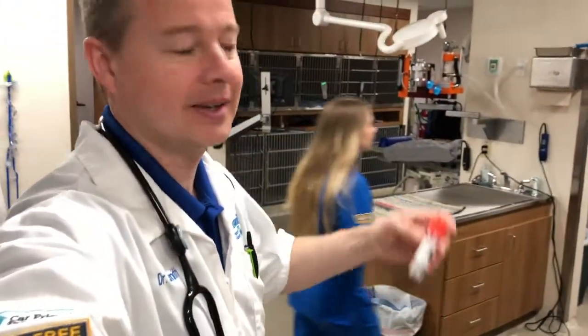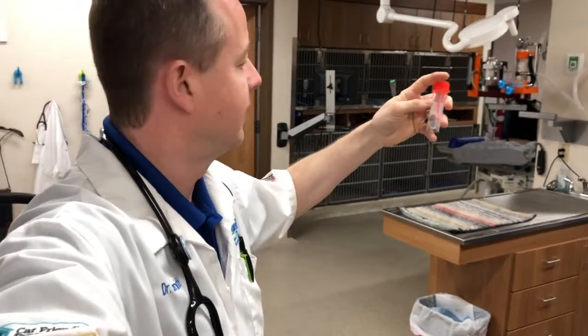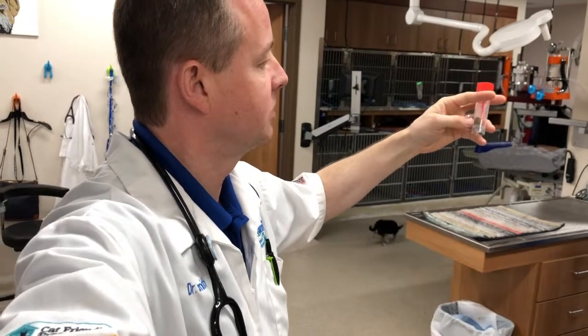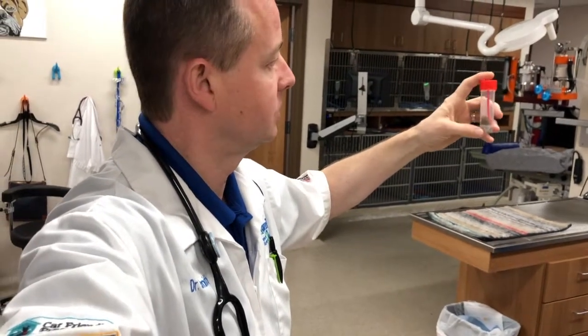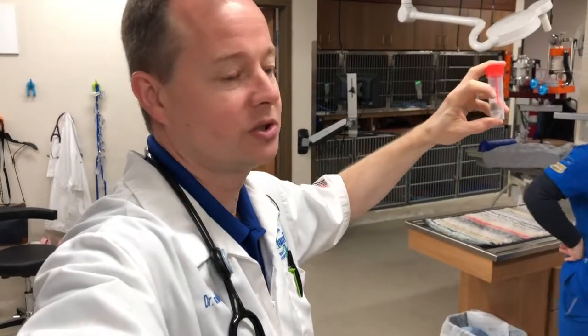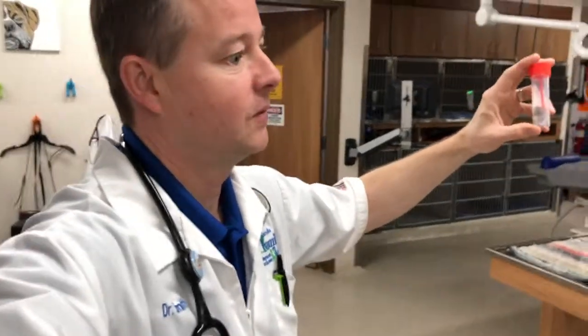We're here at work and I have this little sample — this is what we need to do our test. This is probably twice as much sample as we need in this little jar. Sometimes people bring us an entire Cool Whip tub packed full, which is too much. We need a fresh sample; it's got a little moisture still in it because the parasite eggs are alive in there, and that's what we're going to be testing for.